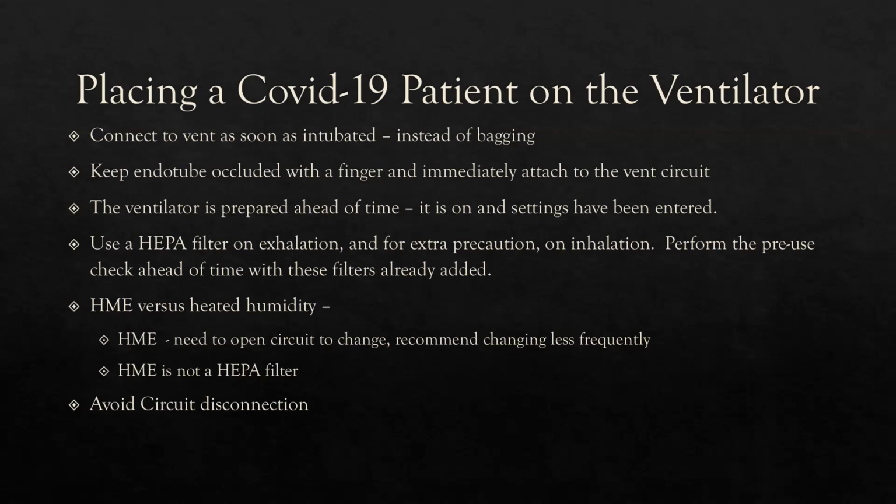Lane at regional told me, and I don't remember who else I was with, to not change that HME so regularly because it's dry if you keep changing it, and it's not humidifying the patient. Exactly. It should be changed if soiled. I think that's just a routine practice, you go in the room, you do the vent check and you change the HME. It's more of a routine, but it's not proper practice. Perfectly stated.